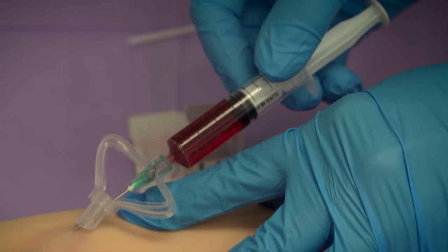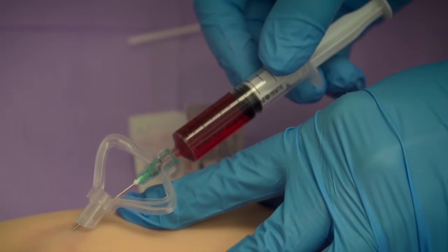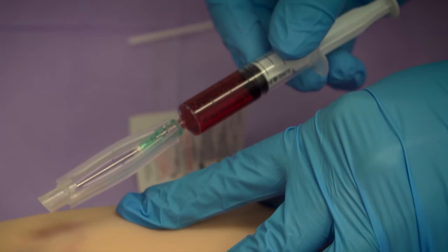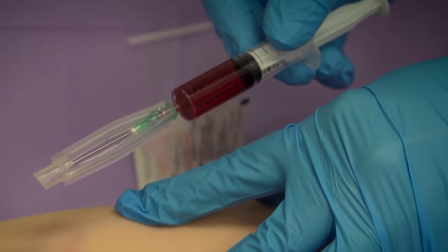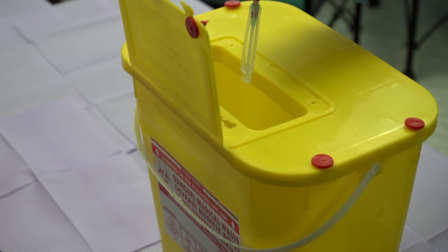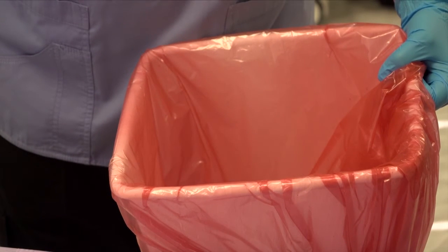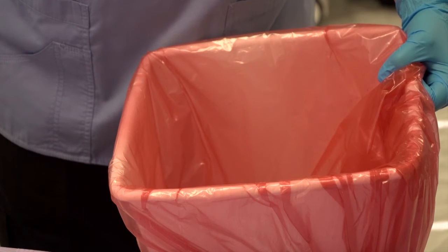Withdraw the needle. Check if the needle's passive safety feature deployed correctly and that the needle is therefore in the safe position with the end cap covering the needle tip. Discard the used needle plus syringe as a unit into an approved sharps waste container. Discard the empty syringe package and needle's straw-like cover in an approved medical waste receiver.